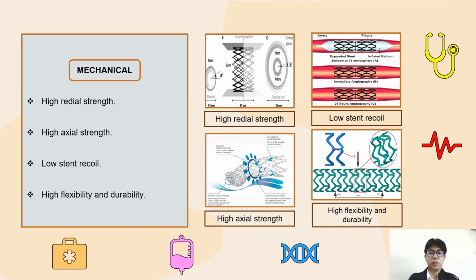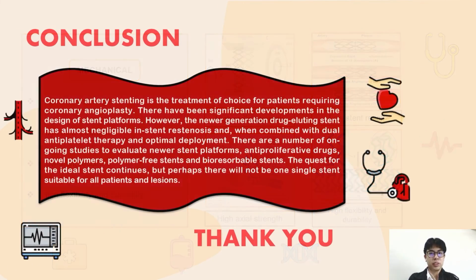As a conclusion, coronary artery stenting is one of the treatment choices for patients requiring coronary angioplasty. There are a number of ongoing studies to evaluate newer stents, anti-proliferative drugs, polymer, polymer-free stent, and bioresorbable stent. The quest for the ideal stent continues. Hopefully one day, the ideal stent is invented and benefits everyone.